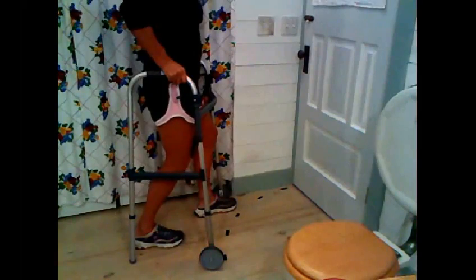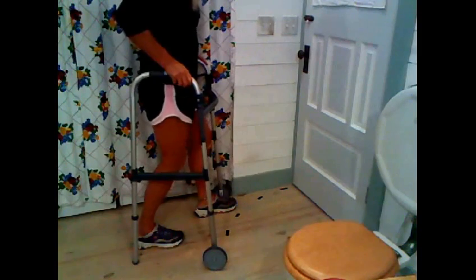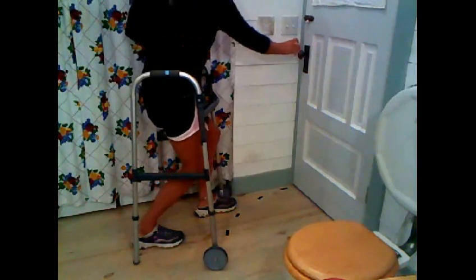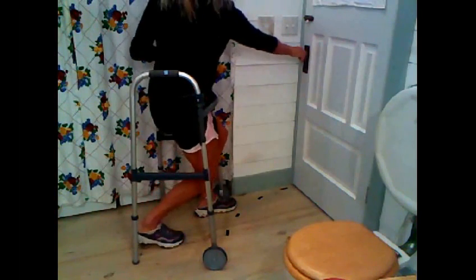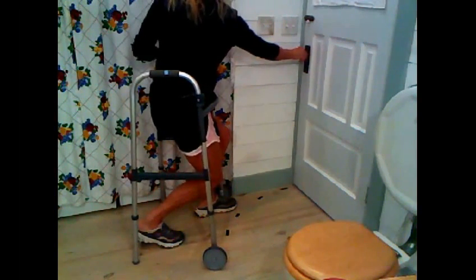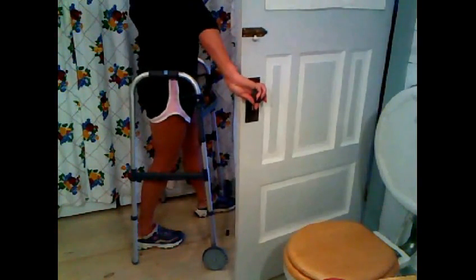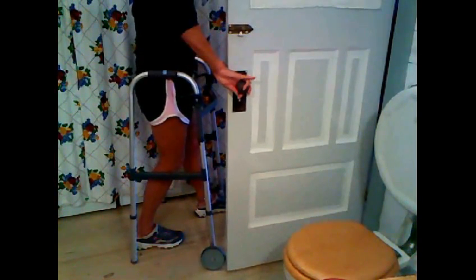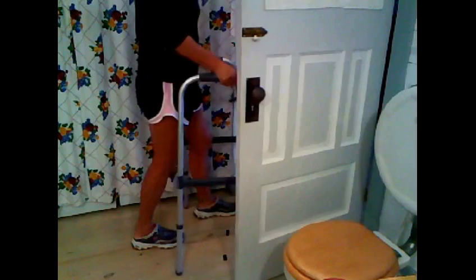Take your split step, and using the outer arm, the one closest to the wall, you can support yourself slightly as you were with the cane. Bend, reach forward, and do the pivot, and watch my shoulders as I pivot. This one goes back even though my hand is still supported on the walker. Pull it open. Now, open it a little wider than usual. Don't let it just get to here. You want it to there, so you can take that one little click and get it in, and out the door you go.